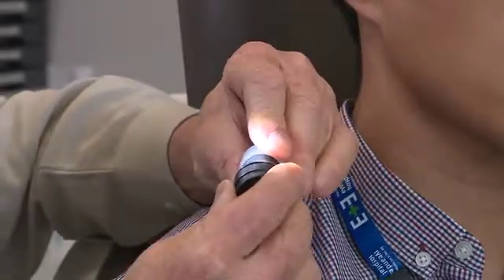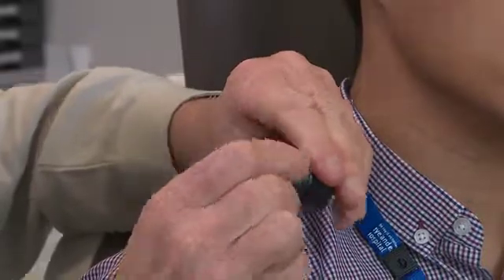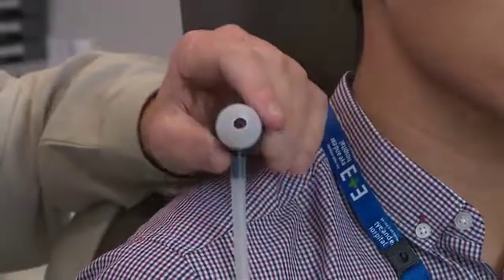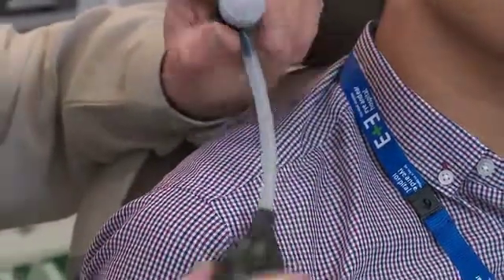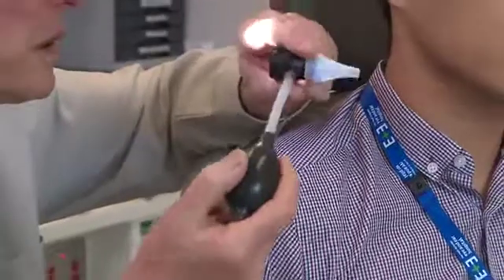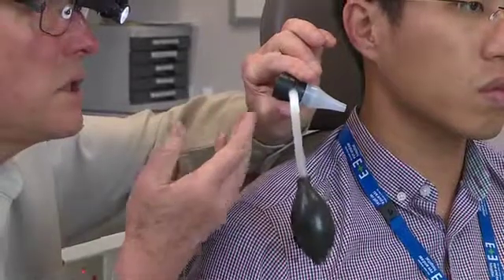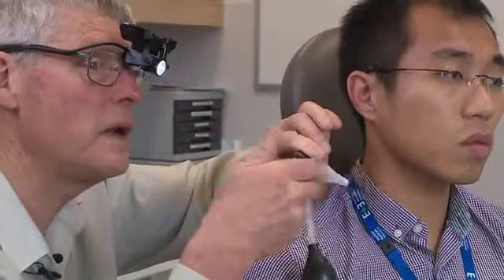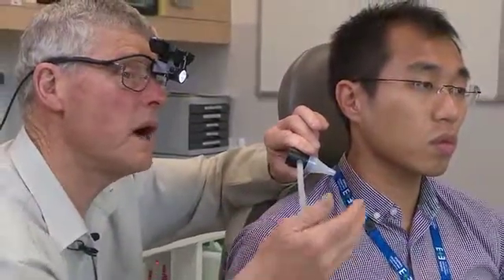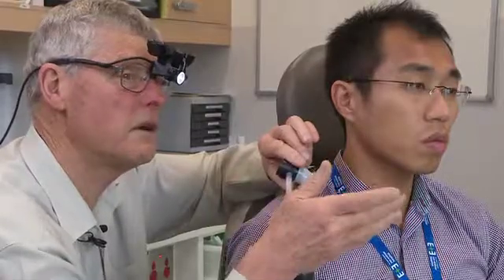If you're looking at an ear and wondering whether there's fluid behind it — like with a child, is it a slightly pink drum from crying or is there acute otitis media? Or is there fluid behind the eardrum, glue ear? If you move the eardrum while you're looking, and you've got rid of the wax and you've got a really good view with extra magnification, you will see if there's air behind it and it's healthy — it will flap in and out really quite quickly. And if there's a lot of fluid behind it, it'll still move, but it'll be much slower. And the thicker the fluid, the slower it is.